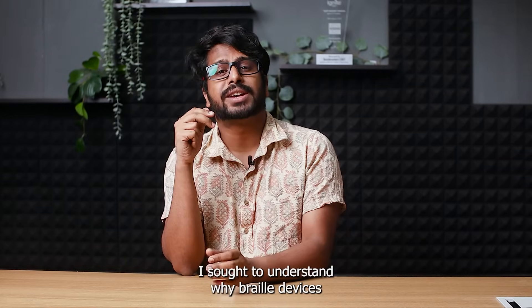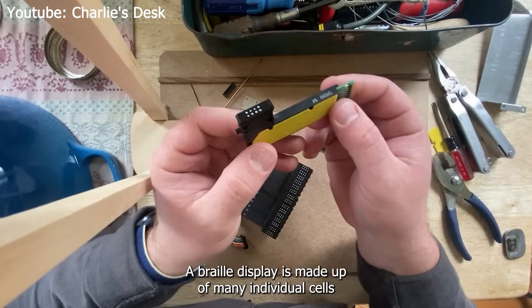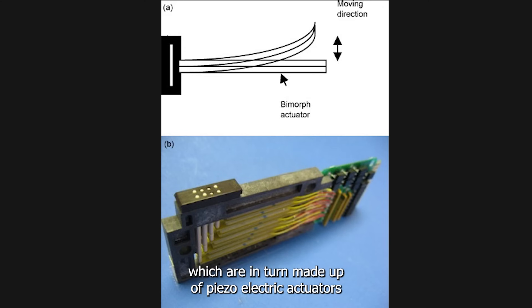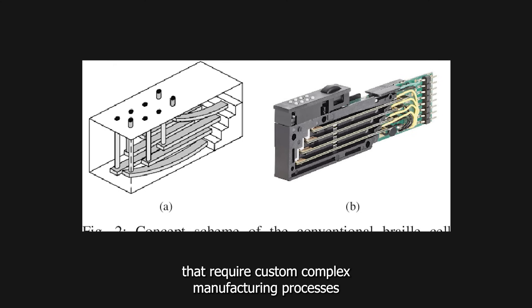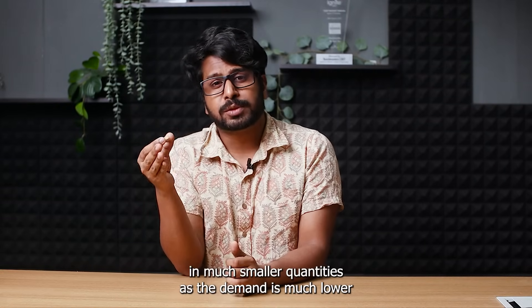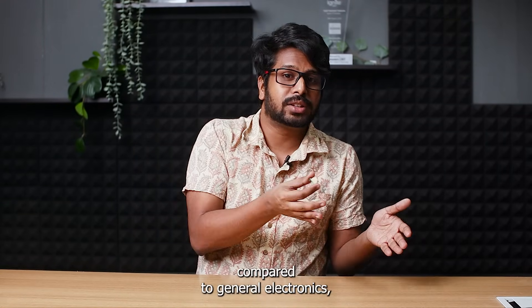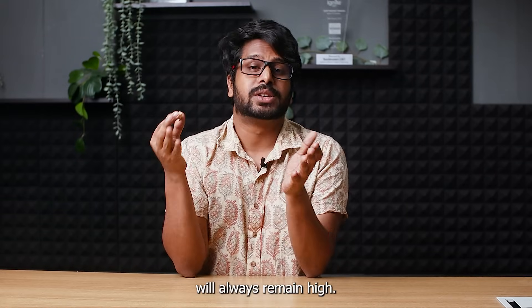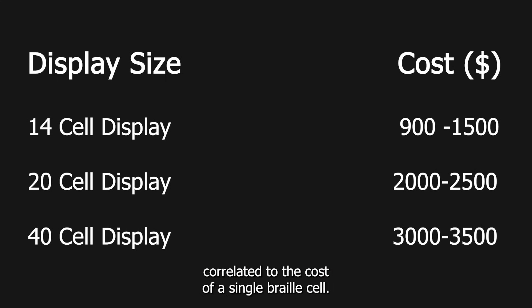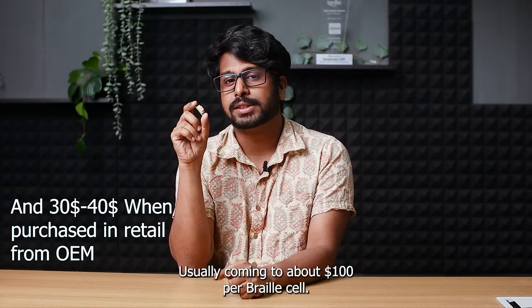Thinking from first principles, I sought to understand why braille devices were so expensive to begin with. A refreshable braille display is made up of many individual cells, which are in turn made up of piezoelectric actuators that require custom complex manufacturing processes to fabricate. And since assistive devices are produced in much smaller quantities as demand is much lower compared to general electronics, the cost of an individual braille cell will always remain high — and the cost of a full braille display is directly correlated to that, usually coming to about $100 per braille cell.